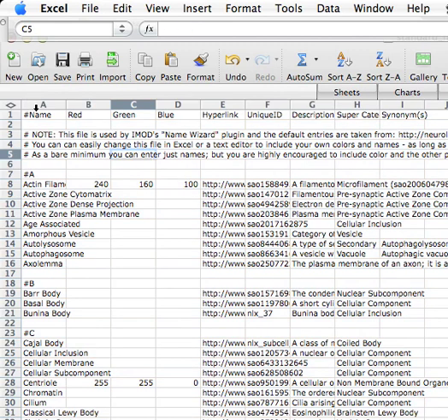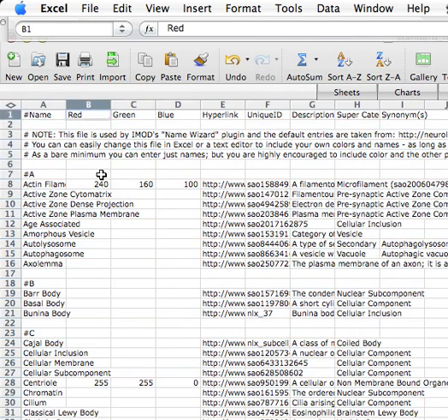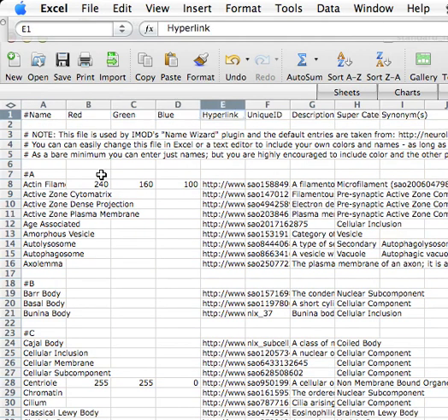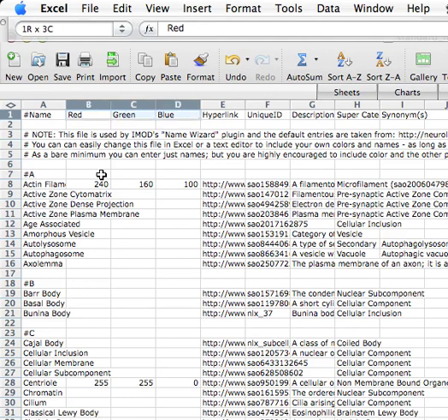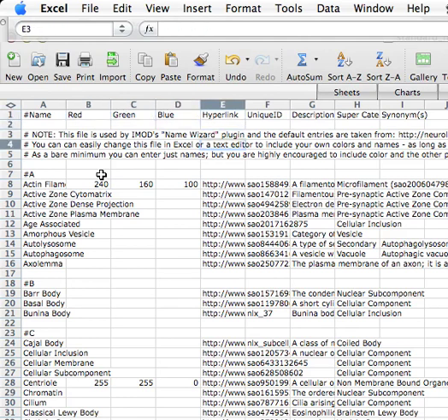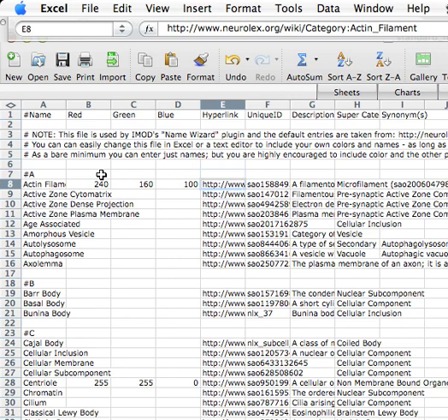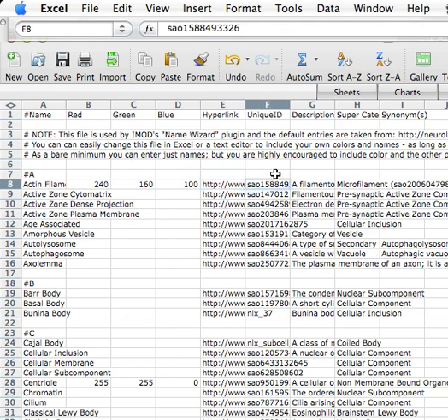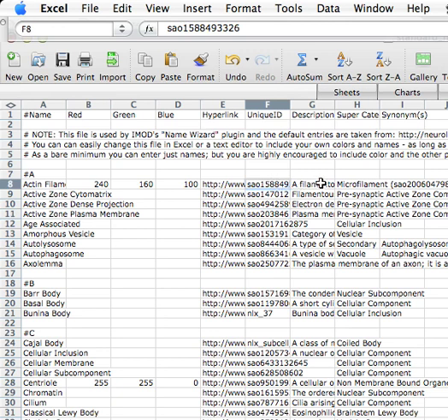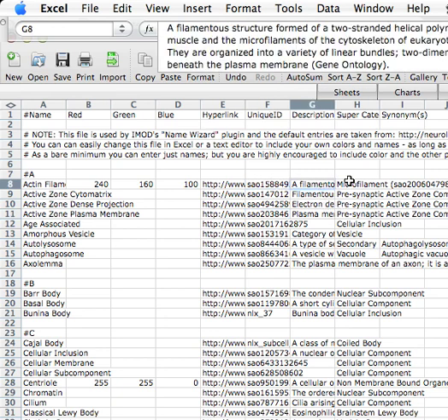These are the different fields we've got: name, then the color components red, green, blue. That's the preferred color for your particular group. The hyperlink links to the Neurolex database by default. Unique ID is the unique ID for the organelle. That's really important because often certain types of organelles may be given different names. Even though it's the same organelle, it might be given different names, and those names can change over time. This will stay consistent, however.